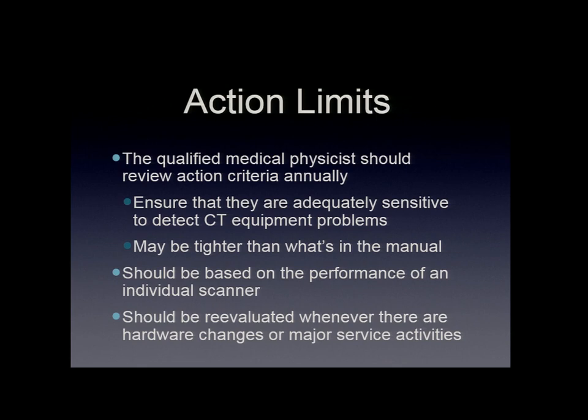And if there are any hardware changes or major service activities, you need to make sure that QC is evaluated before you move on and start doing patients. And so if QC seems to be tight after a change, a service upgrade or something like that, then it might be fine to just continue to perform without any further intervention. But it's best that the qualified medical physicist be contacted to see if there is a need for any more comprehensive evaluation, an equipment evaluation, such as after a tube change.